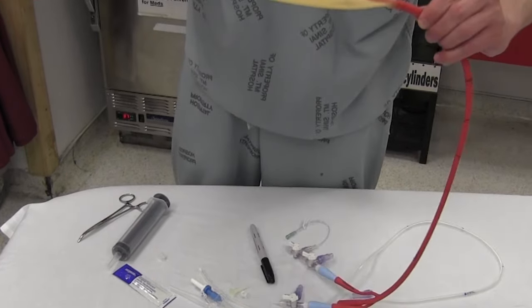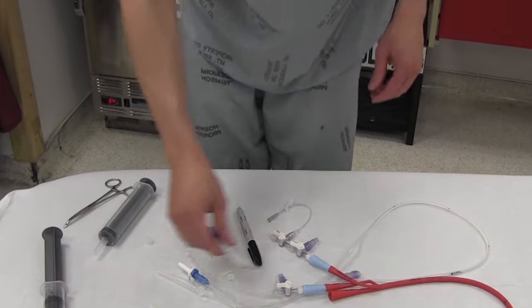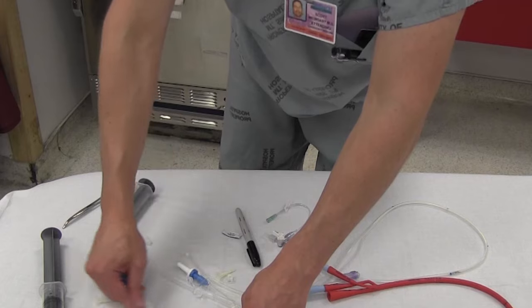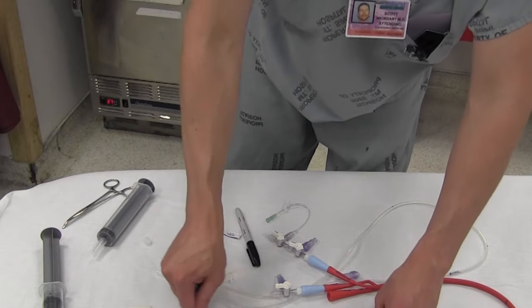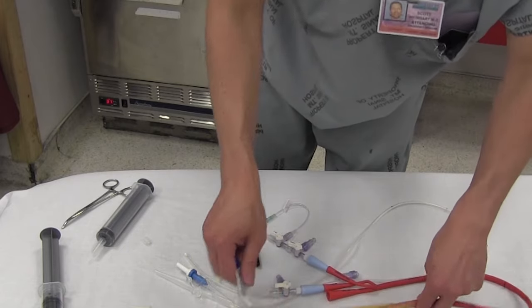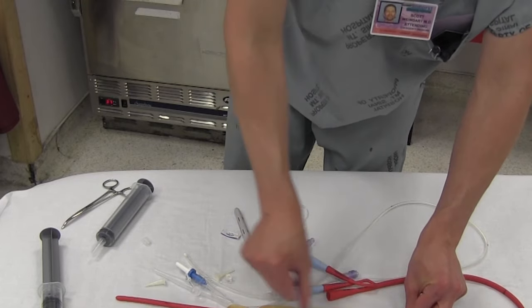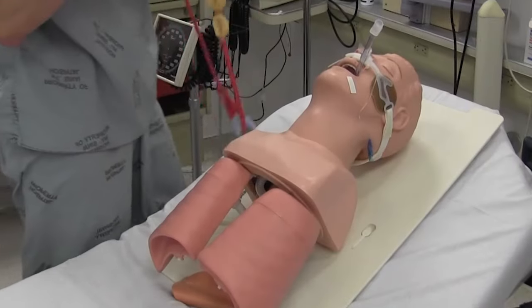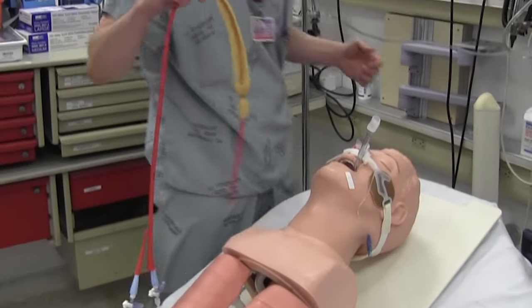Now that one's totally flat. We're going to lube the hell out of it — get the balloons too. Now we're actually ready to insert the Blakemore.